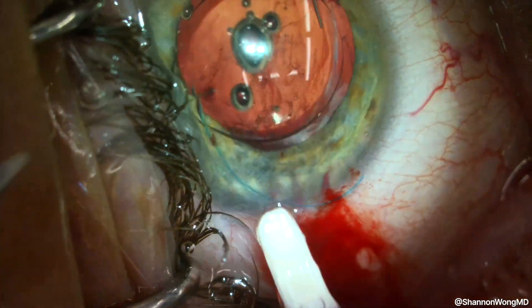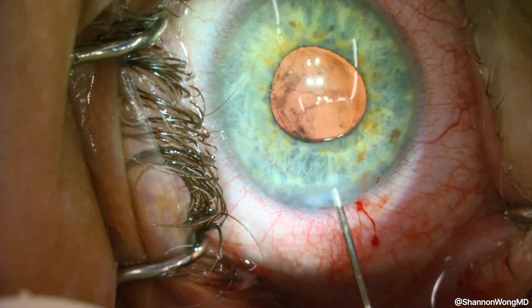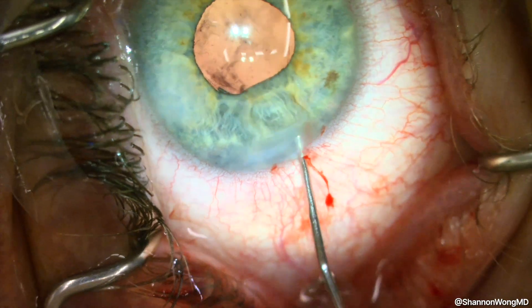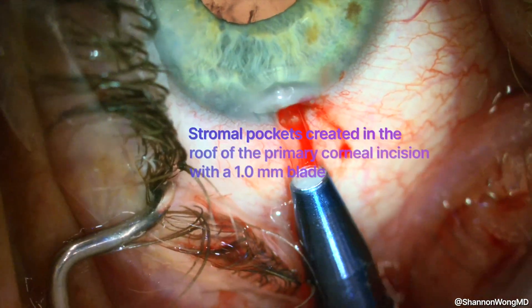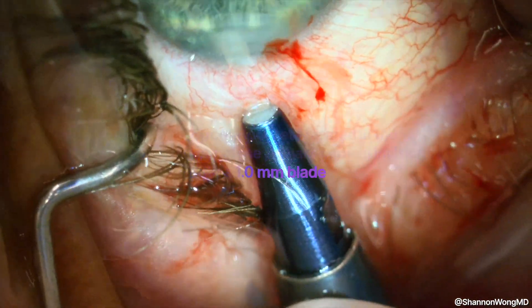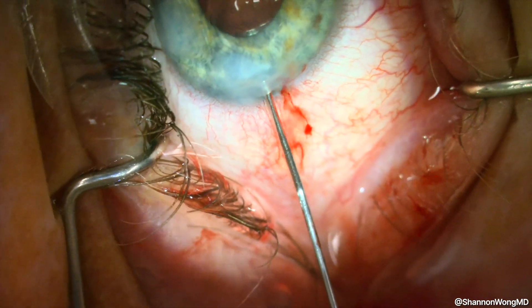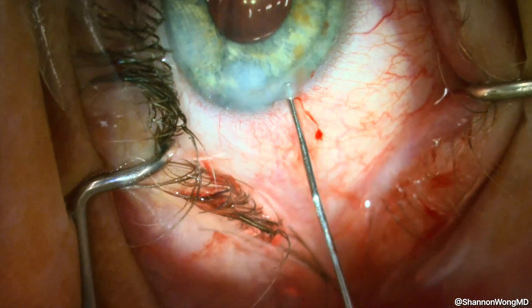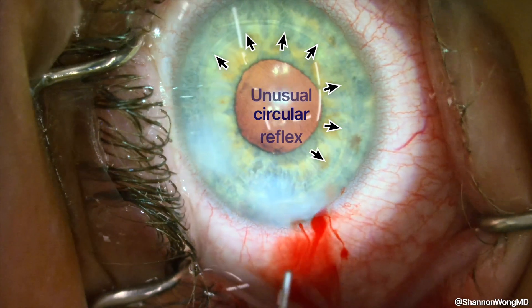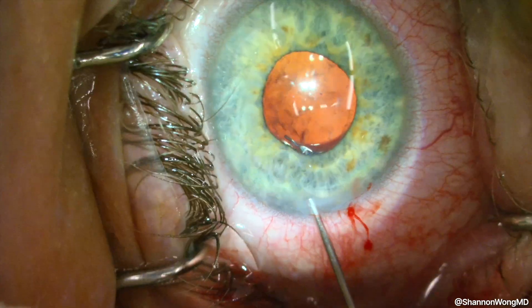Everything was going well, and I'll walk you through some clips of the case. But at the end of the case, you're going to see that I'm hydrating the primary incision we created with a diamond keratome, and all of a sudden I notice an abnormal appearance to his cornea. I think, is this a Descemet's detachment?